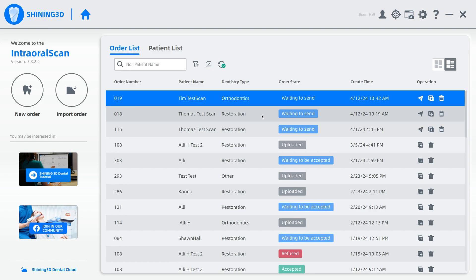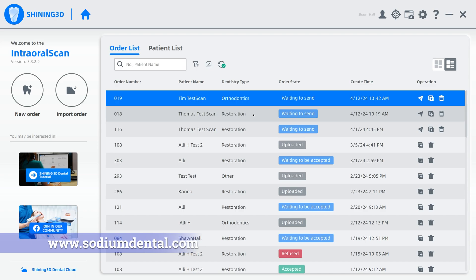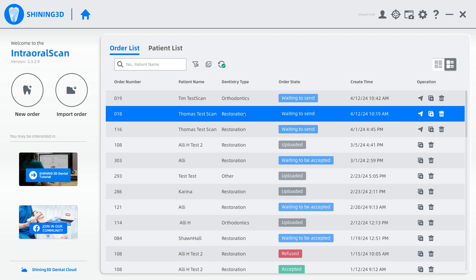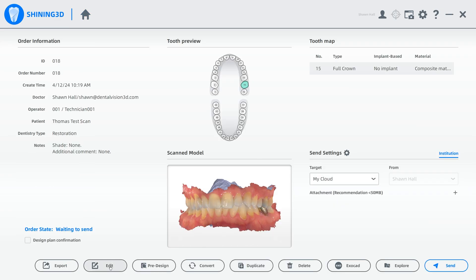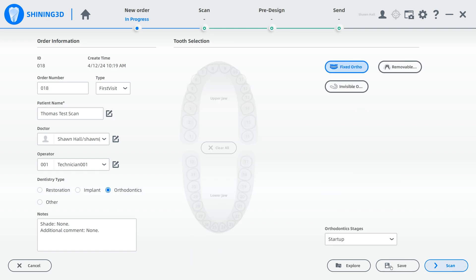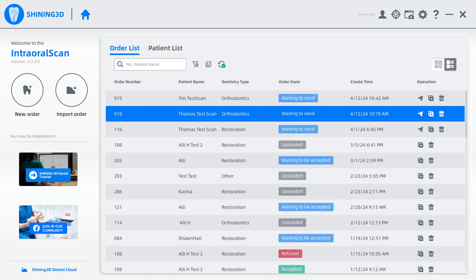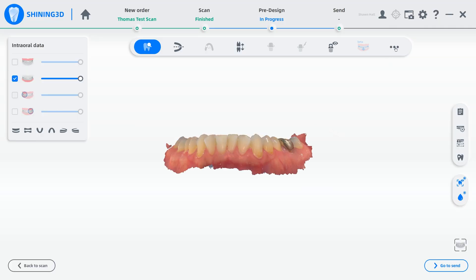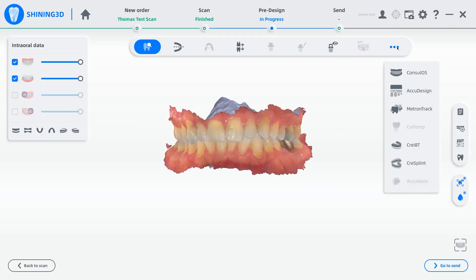The Cree splint only works if you have an orthodontics type scan. So if you scanned and you chose restoration when you did the scan, but you'd like to go in and use the Cree splint module to make a bite splint, just double-click the order, hit edit, change it to orthodontics, and hit save. Then hit back and reopen it, and now we can go into pre-design, and we can choose Cree splint.